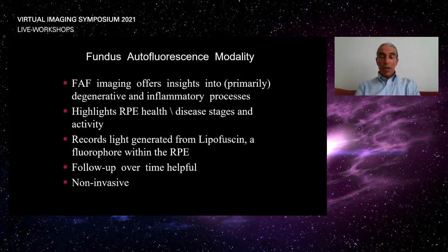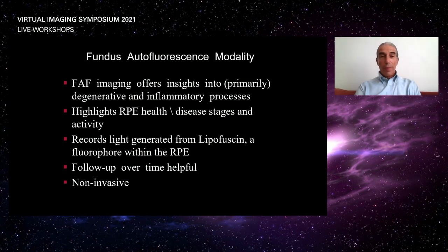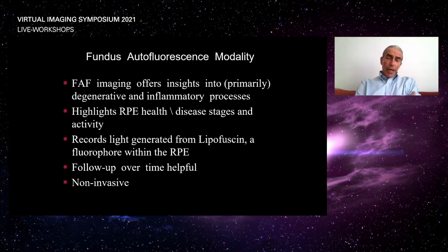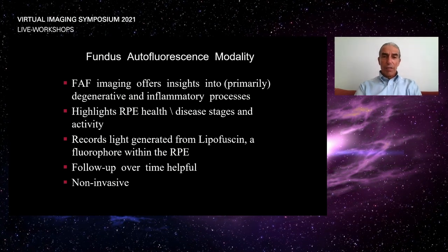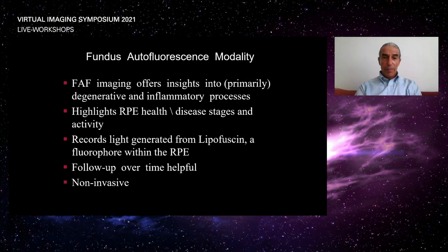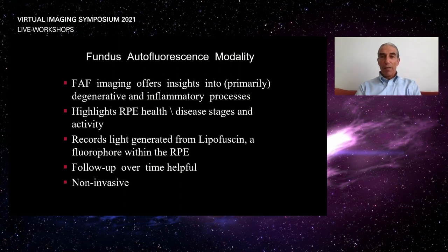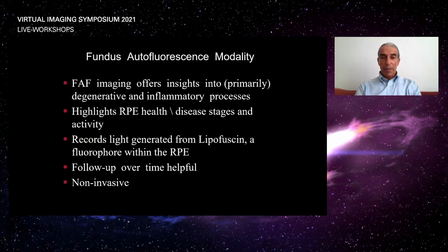Again, before injecting the dye, again with dilation. We can still get away with some autofluorescence without dilation, but it's a little tricky because the pupil constricts under the bright light. The images offer us insights into primarily degenerative and inflammatory processes affecting the RPE health. Now, the beauty of autofluorescence is that it will show us the different stages of RPE health according to the level of disease affecting the RPE.